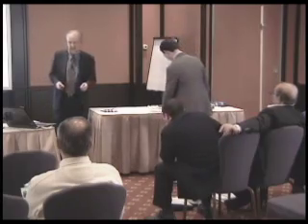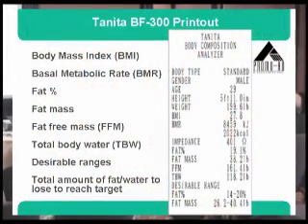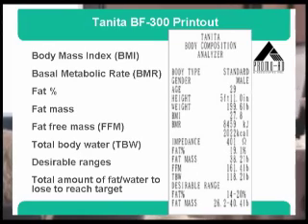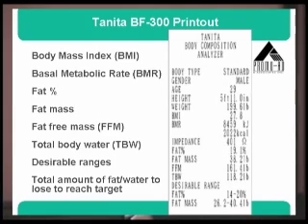So he's getting a printout now. While he's doing that, I'll explain what some of these terms mean. The body mass index we've talked about. Basal metabolic rate, BMR is the short form, is basically how many calories we burn off by just sort of sitting around. It's what our body just will burn off. And this individual here is 29 years old, male, 5'11", 199.6 pounds, BMI of 27.8. So this individual is overweight. BMR burns off actually about 2,000 calories a day. So theoretically, if this person was sitting watching television and not eating potato chips at the same time, and was just taking in 2,000 calories a day, they shouldn't gain or lose weight.